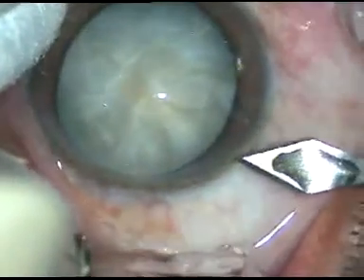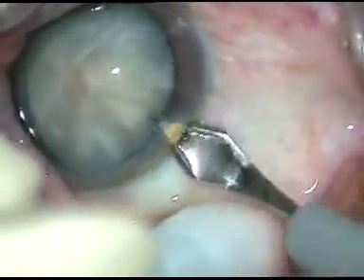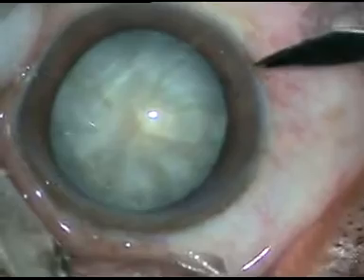This is a full surgery. Let us watch the surgical steps. The main incision in this case is at around 11 o'clock. Now, this is the side port at around 8 o'clock.